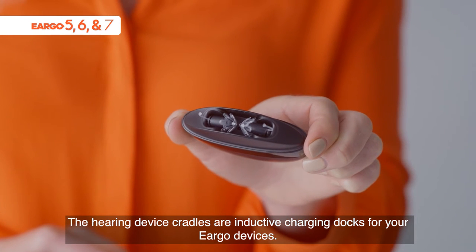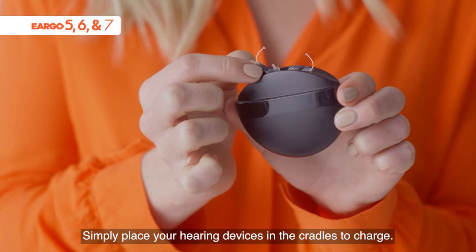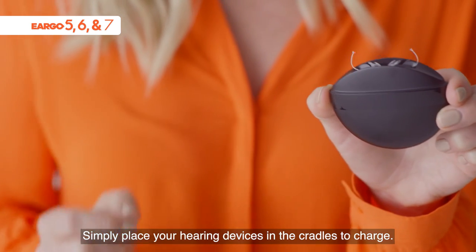The hearing device cradles are inductive charging docks for your Eargo devices. Simply place your hearing devices in the cradles to charge.